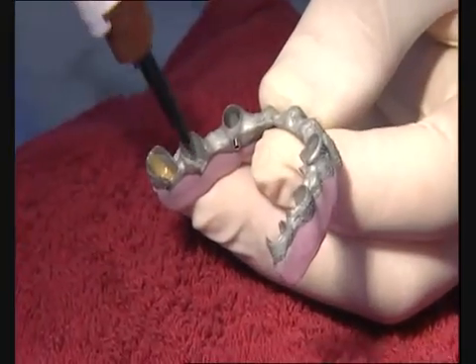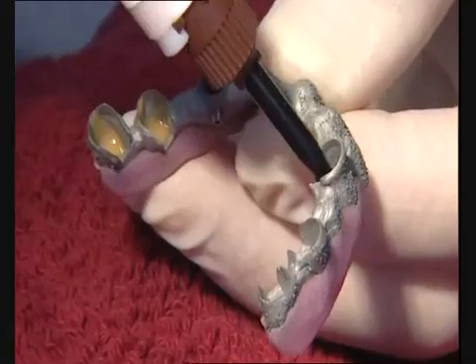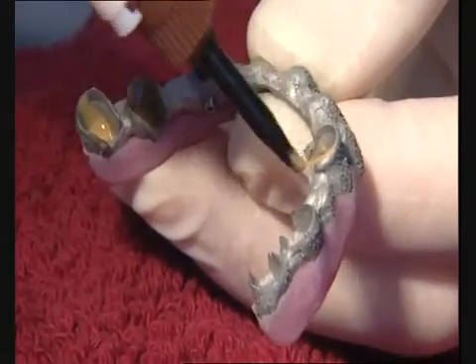The framework is removed. The titanium copings are placed in situ, conditioned with primer, and coated with chemically cured adhesive.